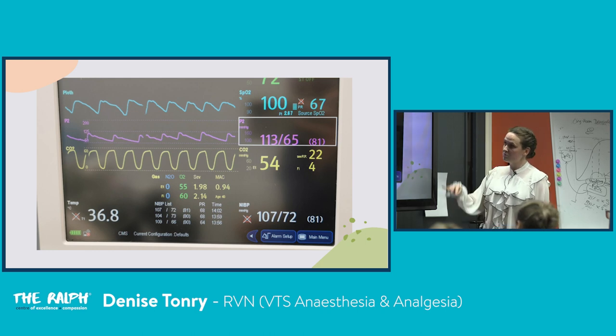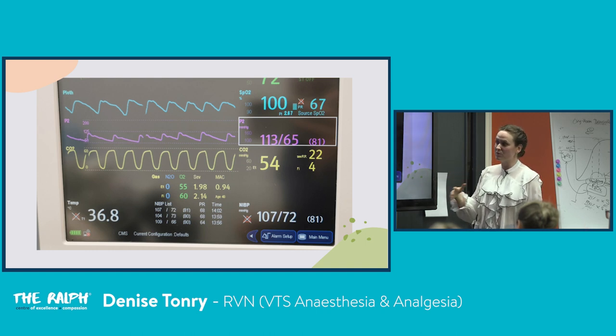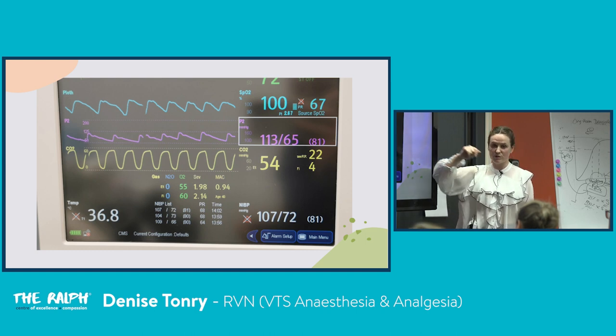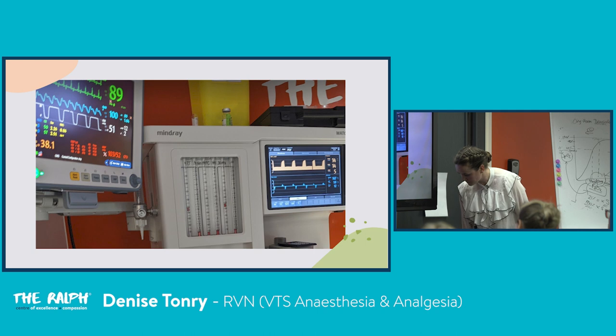This patient, for example, I would leave at 54. I'm not concerned in any way. Normal heart rate, blood pressure is good. I have a fraction inspired CO2. That's potentially dead space for us because we have a lot of connectors just because of positioning of patients. But in this case, I wouldn't ventilate this patient unless, maybe we ventilate these patients if we think they're going to be under anaesthetic for 3 or 4 hours and this is not going to get better. So then we'll ventilate them, but it's more preemptive than a treatment at the time. We don't feel the need to treat that at the time.